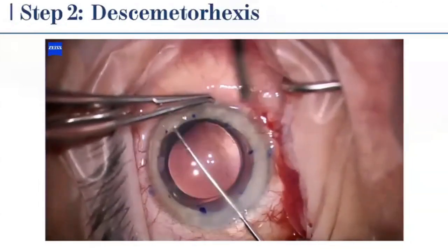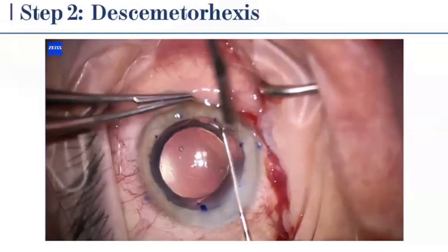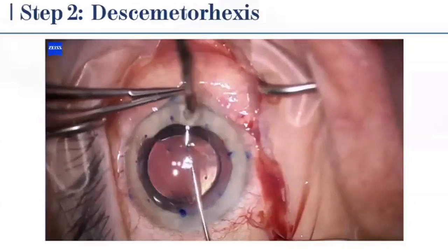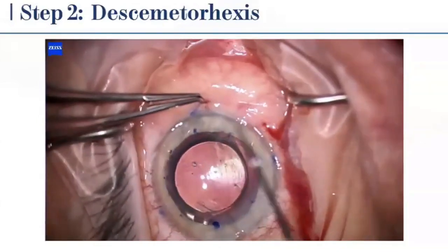Step 2, the Descemet stripping. You will use the reverse Sinskey hook, and it also helps me to use the red reflex illumination for enhanced visualization. Very important here is not to press in too hard because you can cause stromal damage.